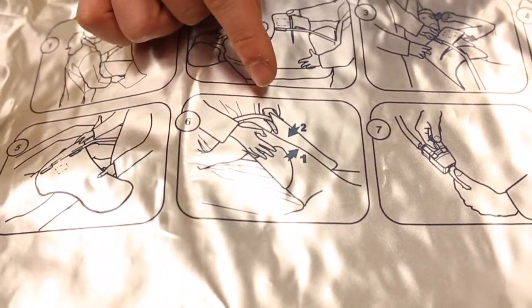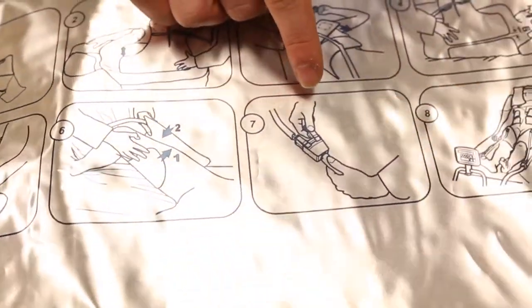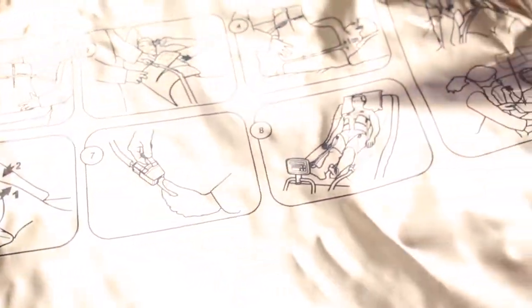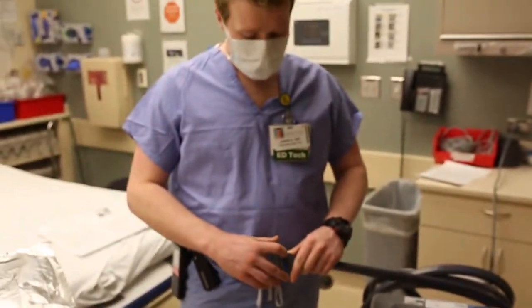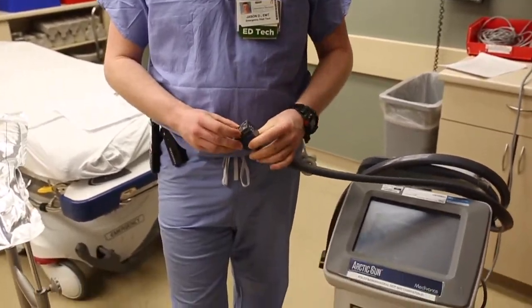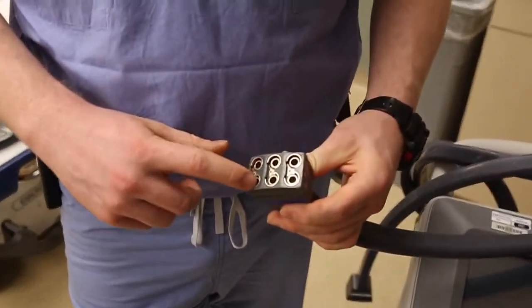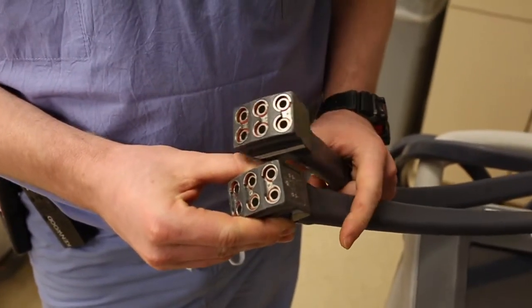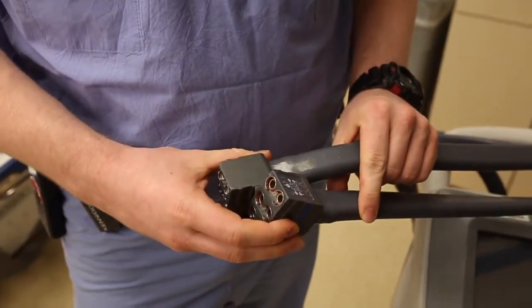There will be instructions on which pad goes where. After everything's attached, plug it into the machine. We won't open the pads since they're expensive, but each has a blue side and a white side. Line those up and plug them in here. There are six ports where each of the four pads will plug in.